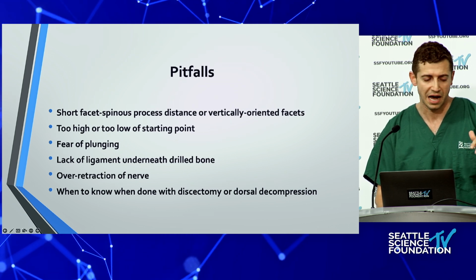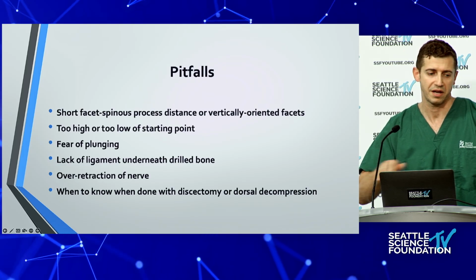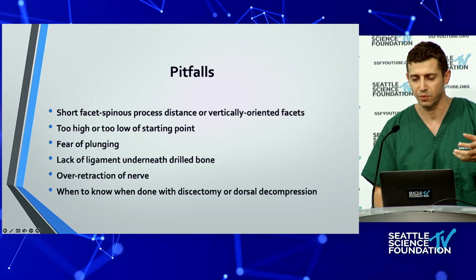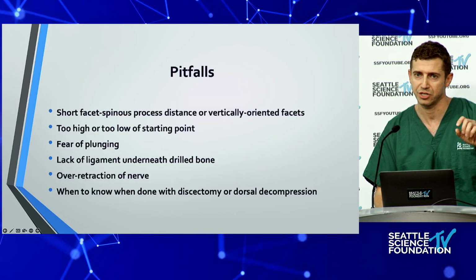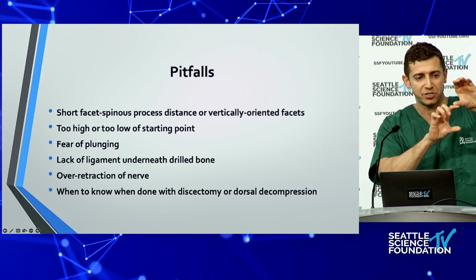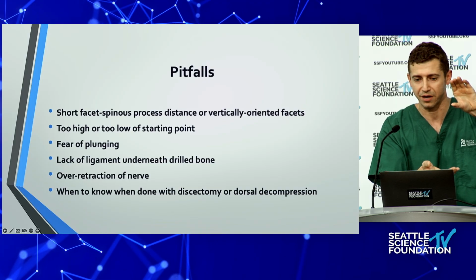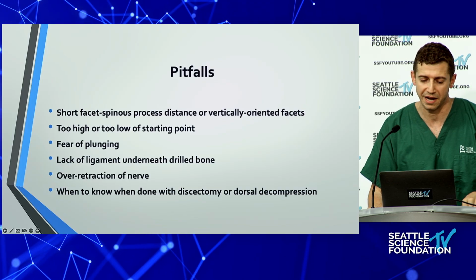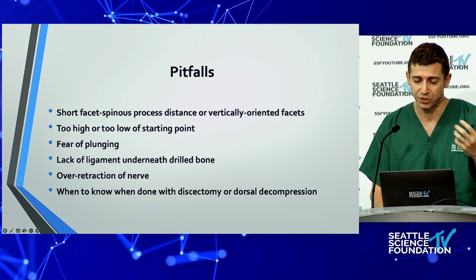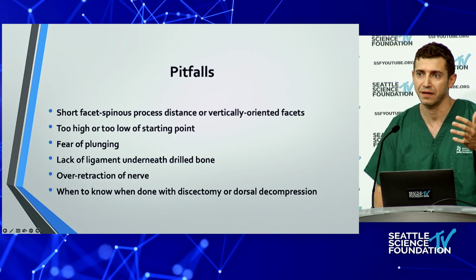For a discectomy, I just look at, for L5-S1, the back of the L5 body, the back of the S1 body, and I make sure everything is flat in between the two. When you do that, then you know that you're done. And usually when you're done, because of the way that the water pressure is and the light in the endoscope, you see the nerve root, and then there's a gap between it, and then there's the floor, and there's a shadow from the nerve root that goes down onto the ventral aspect of the canal, and that's when you know that you're done.